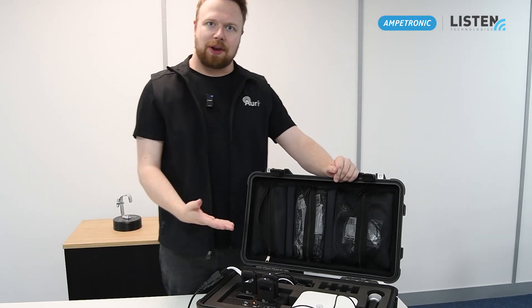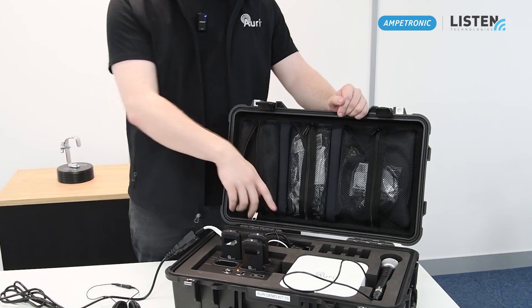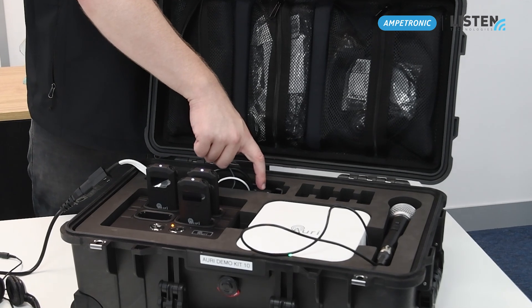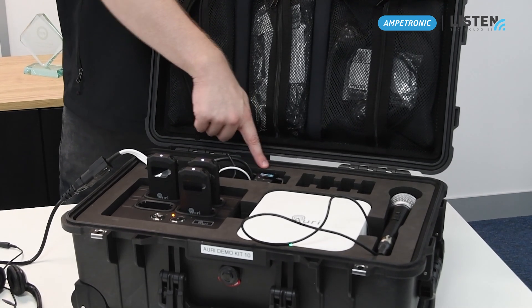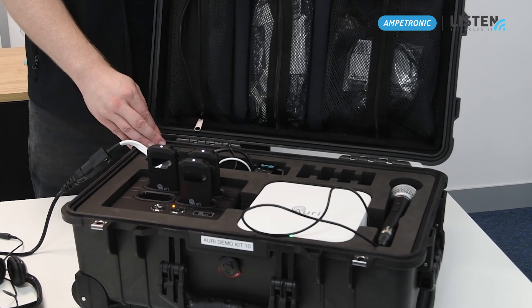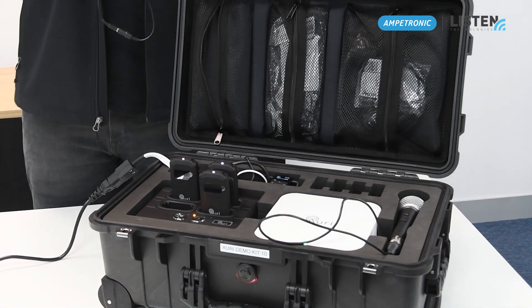There's also a demonstration of the media player with a pre-loaded audio track. First, make sure the media player is enabled and playing — press the top button on the media player, and if the content is not shown to be playing, simply press the play button.